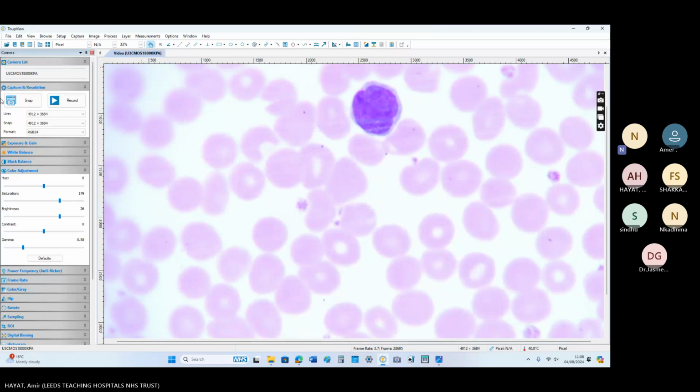So in the exam you were not sure. What would be your safe reporting in that case, or do you just go for your intuition? I would not say it is a B cell lymphoma or T cell lymphoma, because I need flow markers for that to surely say that this is B cell or T cell. If I'm not sure, I would say this is a non-Hodgkin lymphoma, but I need further investigation to confirm the lineage and the type of lymphoma.